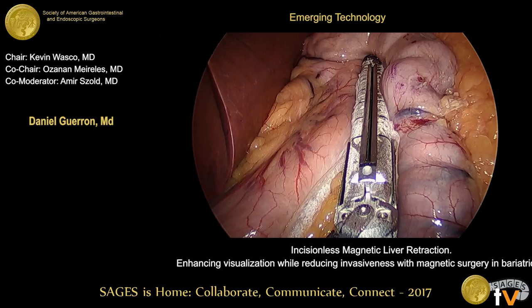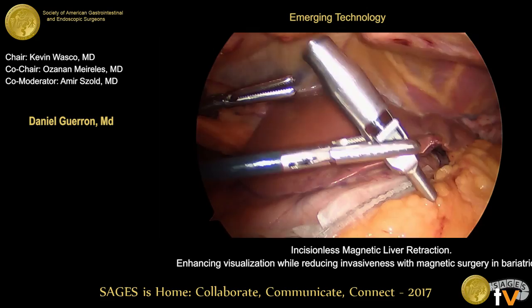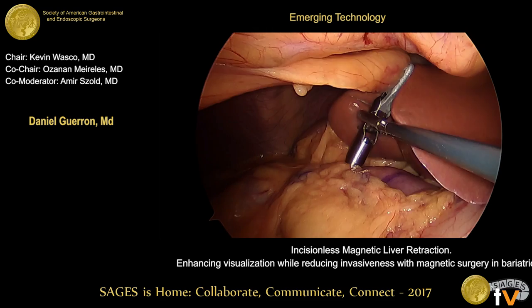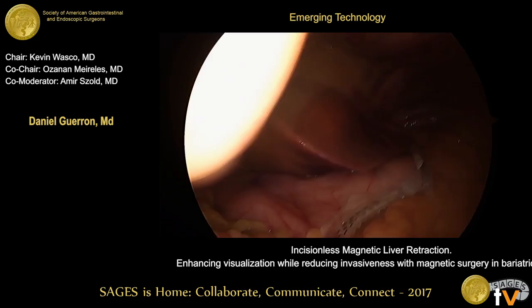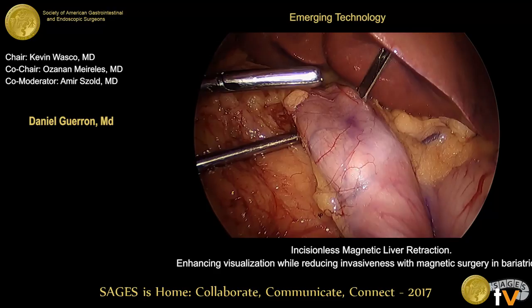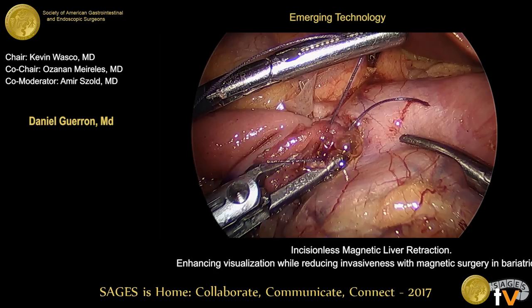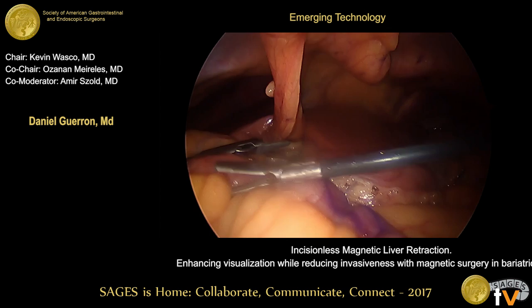A sleeve gastrectomy is then performed safely. The grasper is repositioned at the base of the falciform ligament, and the external magnet is manipulated on the anterior abdominal wall to create attraction, enhancing visualization of the operative field in preparation for the duodenal dissection. We then create the tunnel underneath the duodenum and perform a duodenal-ileal anastomosis with an Endostitch in a two-layer fashion. The device is then uncoupled from the external part and removed from the abdomen.